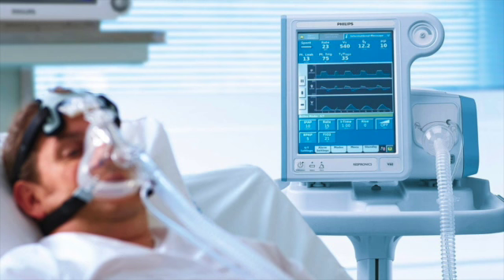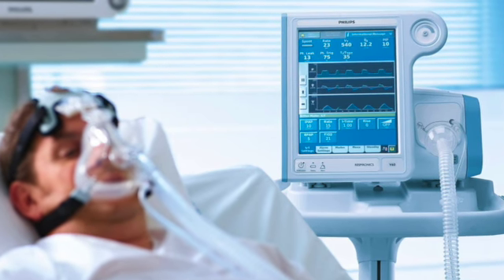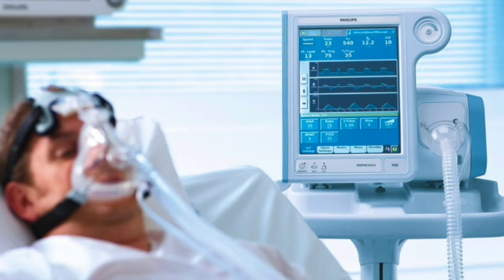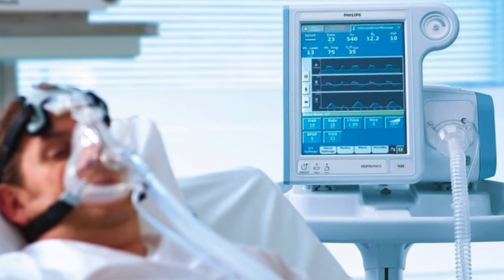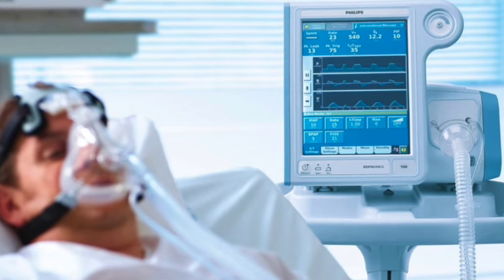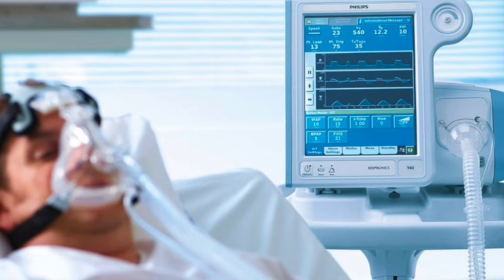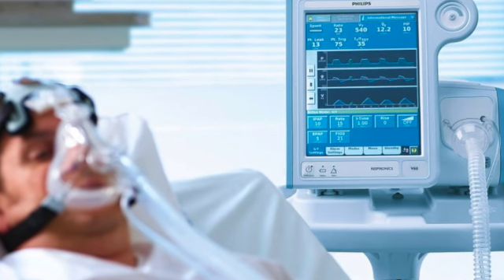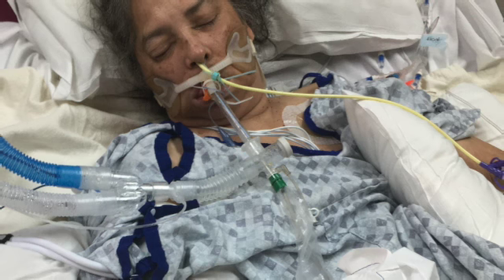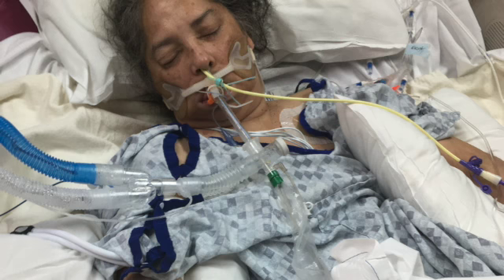The different types. Pressure cycled ventilator, where the air is delivered to the patient until a set pressure limit is reached. Then there's a time cycled ventilator. This is when it pushes air into the lungs for a predetermined amount of time until that has elapsed. And then a volume controlled ventilator, where a predetermined amount of air is delivered to the patient.